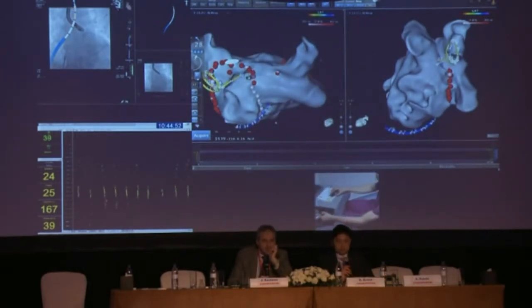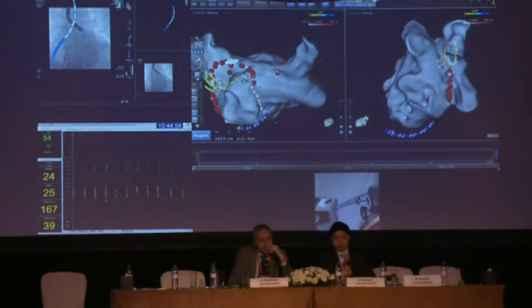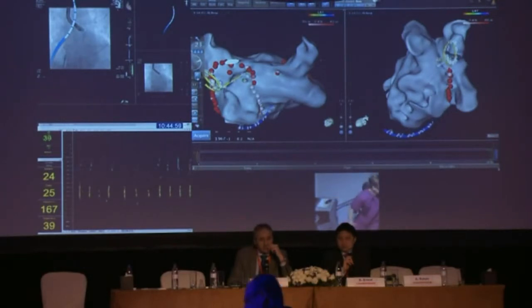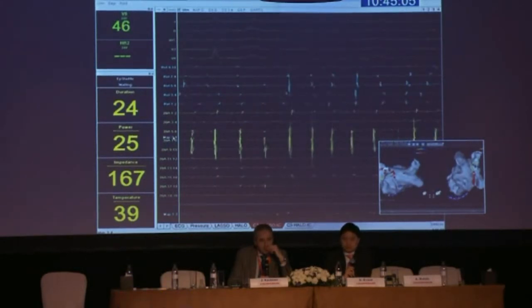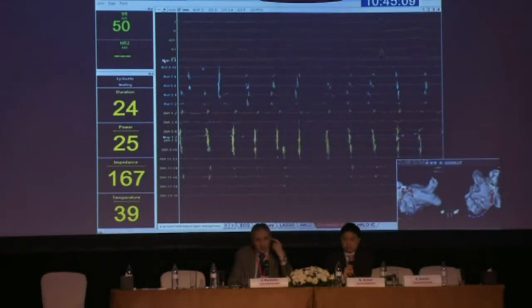On the back wall, I would expect to see much less movement because the heart moves up and down rather than side to side. And I'm happy with anything above 5 grams, frankly.